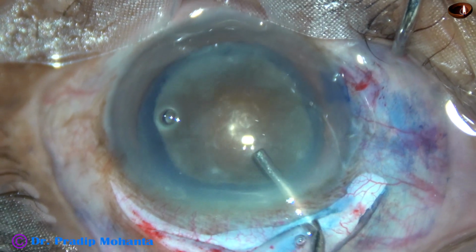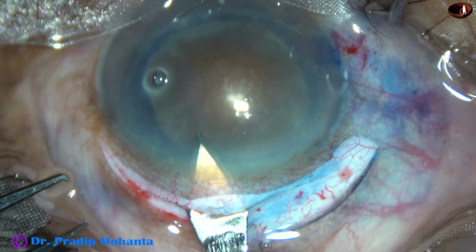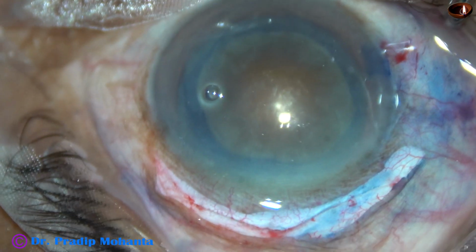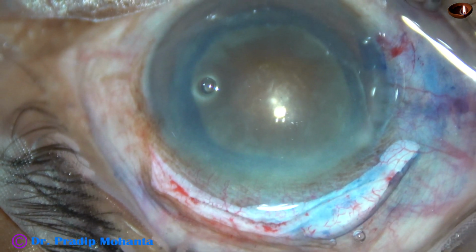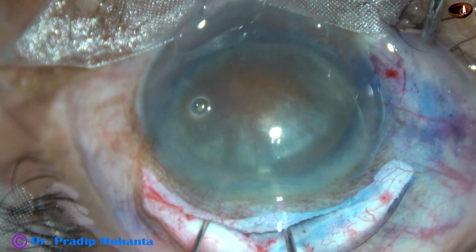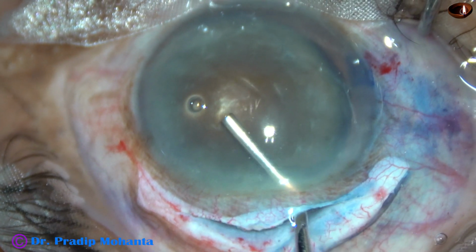And now inject visco and open the tunnel completely from one end to the other end. Always remember that we must cut when we go forward to keep the corneal valve very nice. Yes, this is a self-sealing wound, and only one suture will be applied just to reduce the astigmatism. Again visco, and now I take 2 hooks to prolapse the nucleus. Here it is, and the wound is about 11 mm, so it will come easily by visco expression.